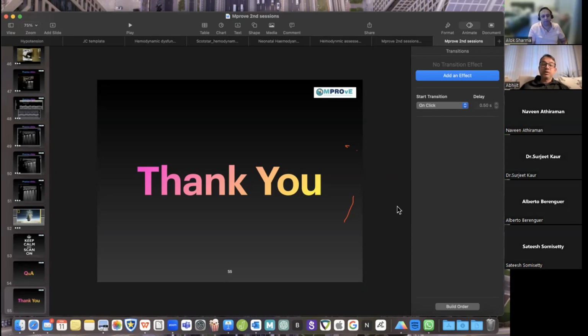Yeah. So you are on top of it. You can definitely see a consolidated area. So now you are in a double mind. Am I actually seeing the vessel or the speckling? Try going up on the scale and try to figure out, try to take the speckle out.